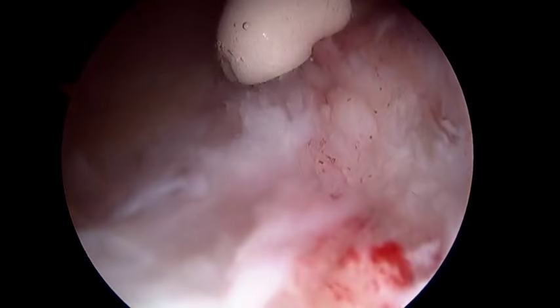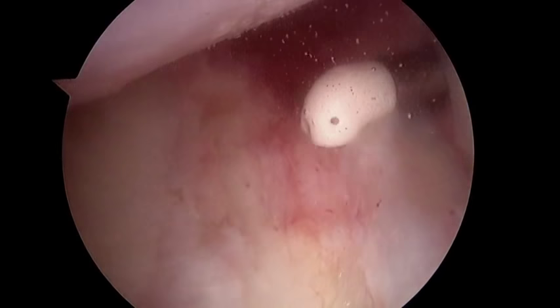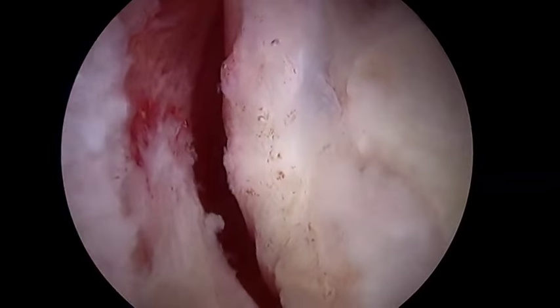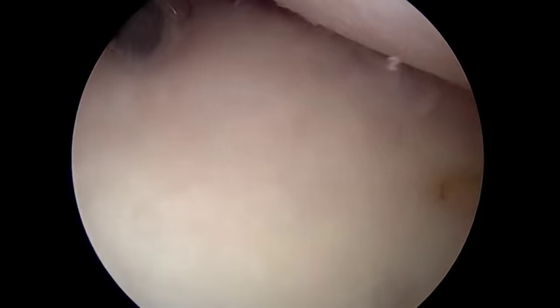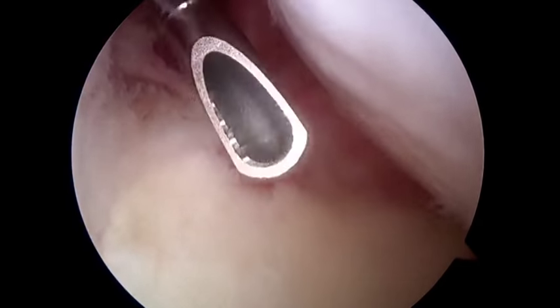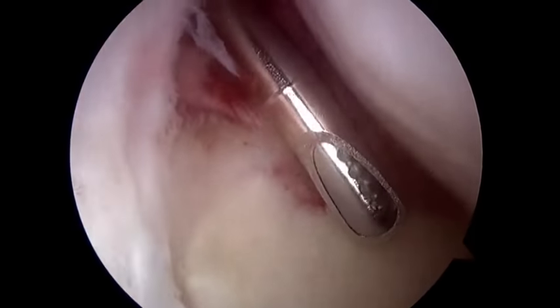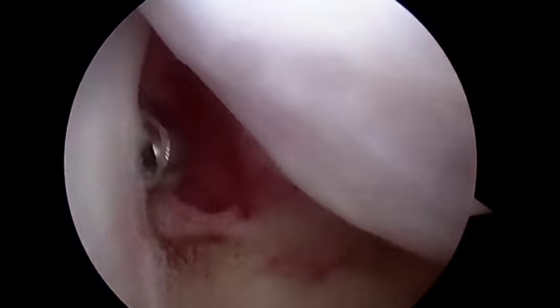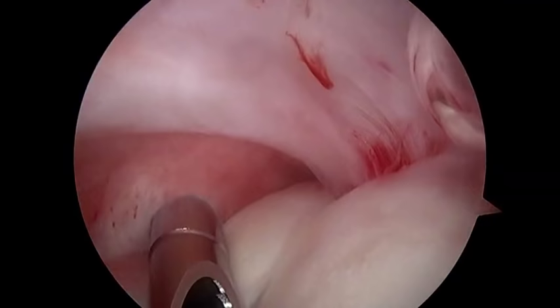So this is an electrocautery device, which helps us control bleeding a little bit. Also helps us contour the shoulder a little bit. So we're just going to clean things up a little bit here. Arthrosuction. So again, we've got good mobility. We've cleaned up the inside of the shoulder joint, or what we call the glenohumeral joint, and we've inspected the rotator cuff from below, and we don't see anything too bad. And we've eliminated all the adhesions.